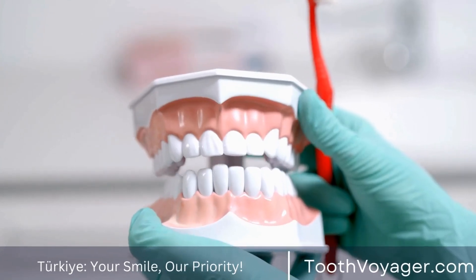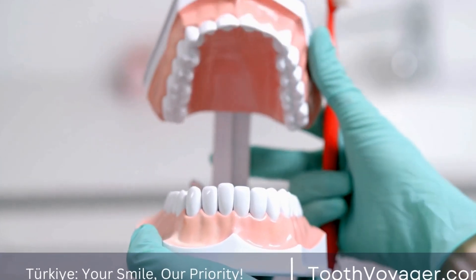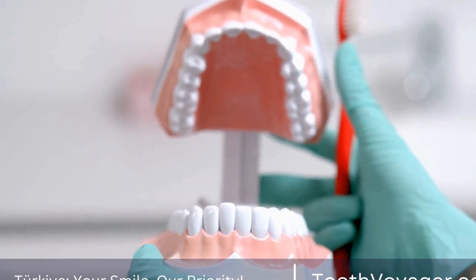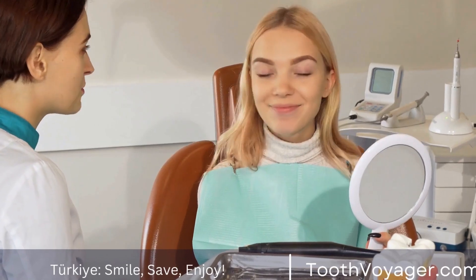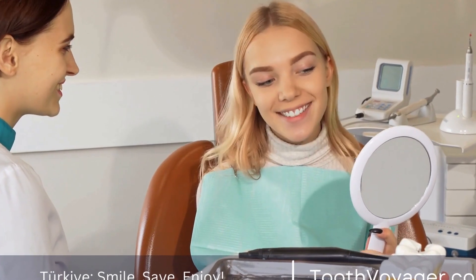Step 4: Abutment Placement. After the implants have healed, abutments are placed on top of the implants. These abutments serve as connectors between the implants and the replacement teeth.